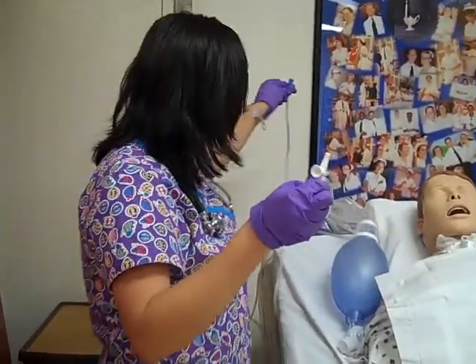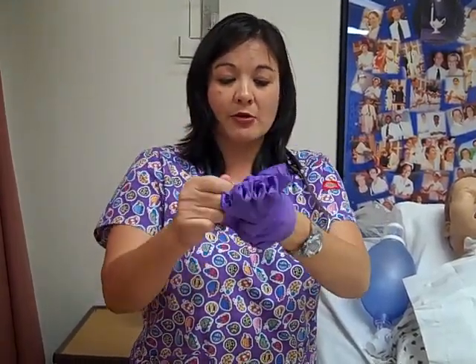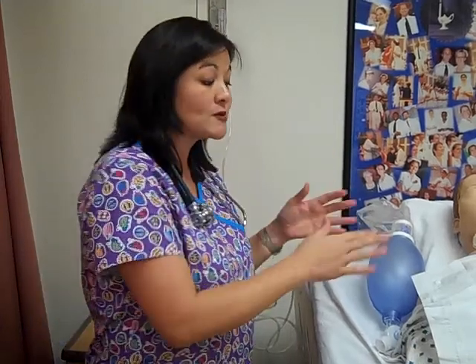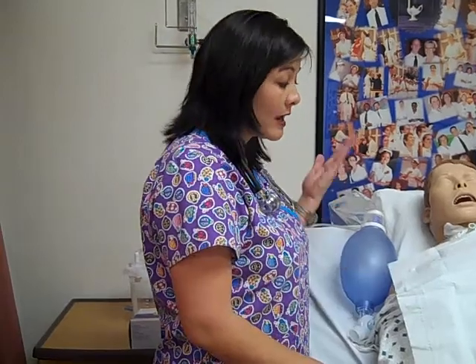Disconnect the catheter. Depending on how your patient is doing, you can go ahead and hyperoxygenate him again — just give him a couple more breaths. Wrap your catheter up in your dirty gloves and throw that out. Go ahead and clean up, and then you are done. Just remember your documentation. You will also want to make sure that you do another respiratory assessment and put your patient back in a safe position — bed down, make sure he's comfortable with his call bell in reach. That ends suctioning.